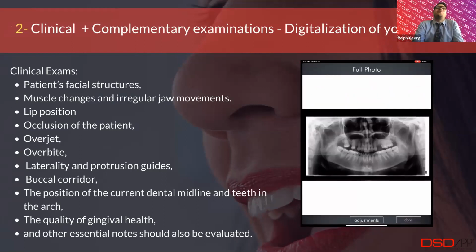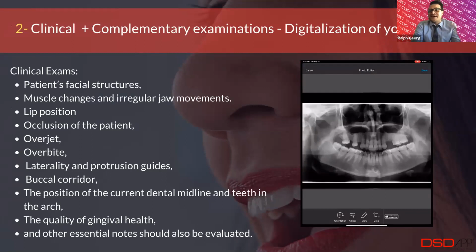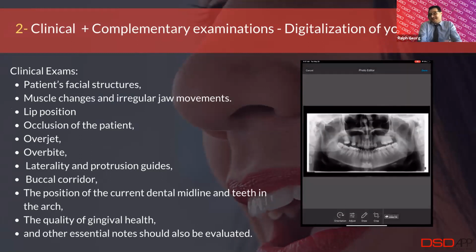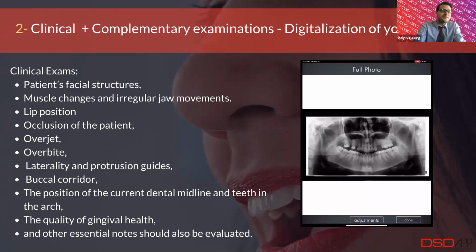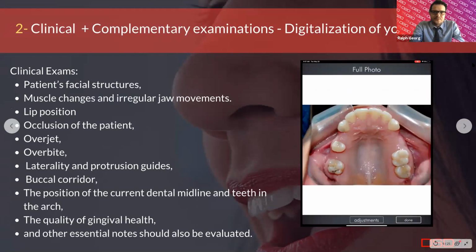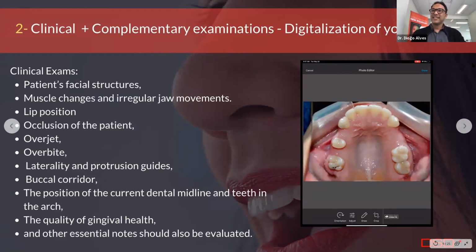Believe it or not, we have had doctors whose UPS guy has come in and they've done that using the app, and they loved it. And they go and tell their wife, and then it's just a great form of advertisement as well. That's great, which you'll explain later.